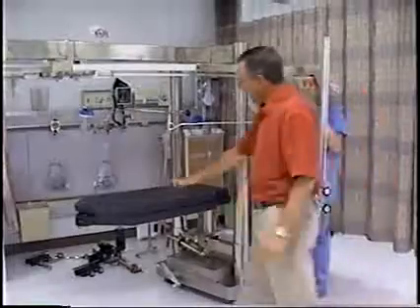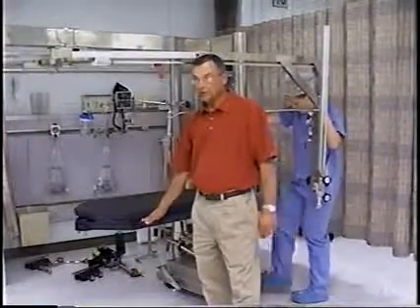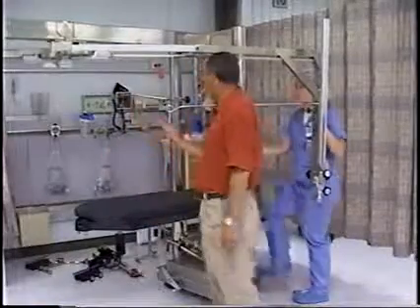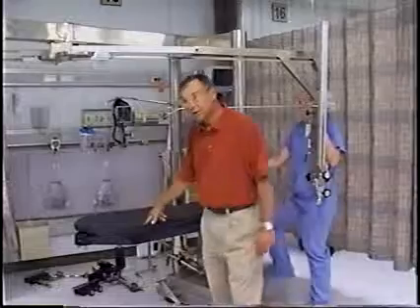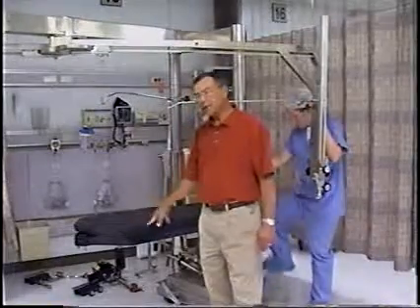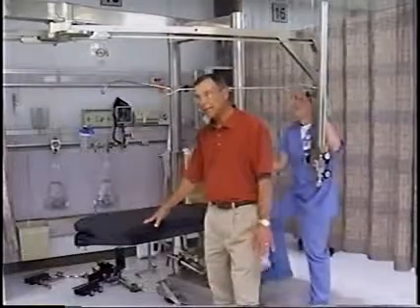This is about 28 inches, which is stretcher transfer height. So you'll want to pump the table up like she's doing as far as it will go until this starts to raise. Once that starts to raise, you stop so that you've got transfer height for the patient.